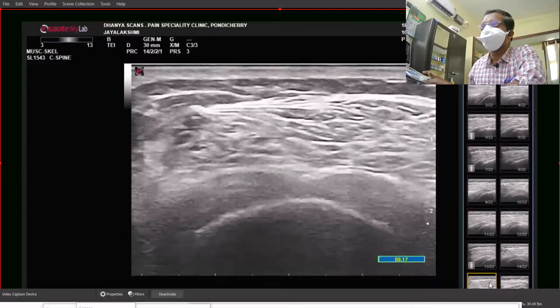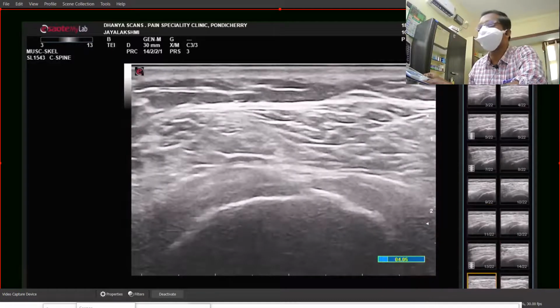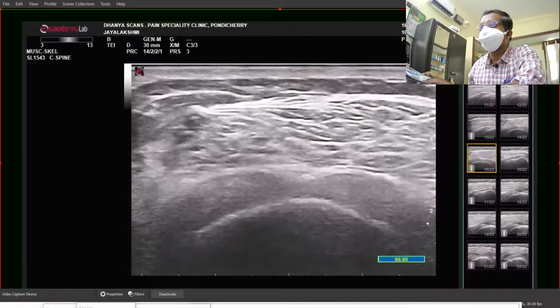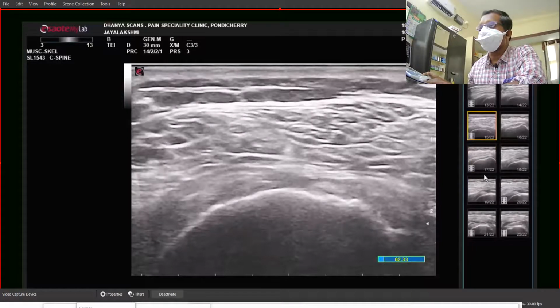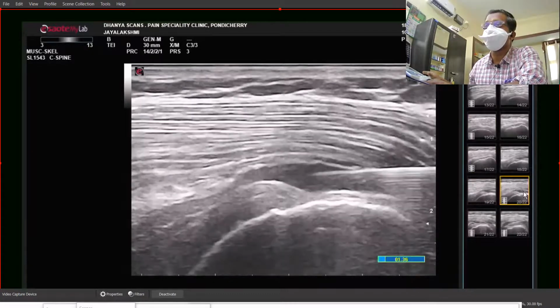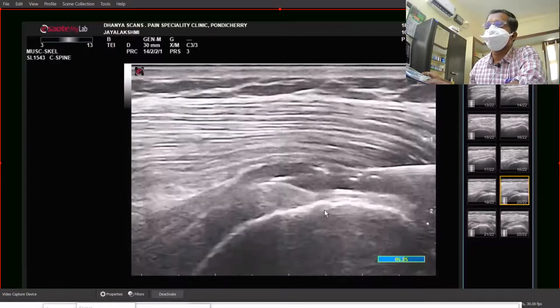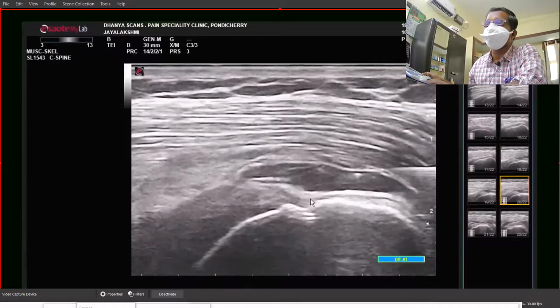So I did a bursa injection for pain relief as well as proliferation of the tendon. Okay, proliferation of the tendon is more important to give pain relief. So I decided to go for injection with dextrose, 5% dextrose being the choice, 5% dextrose injection correctly into the subacromial subdeltoid bursa. This is the subacromial subdeltoid bursa, particularly in a very, very thinned out tendon onto the insertion.